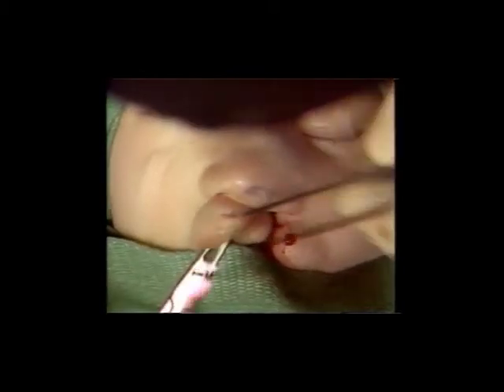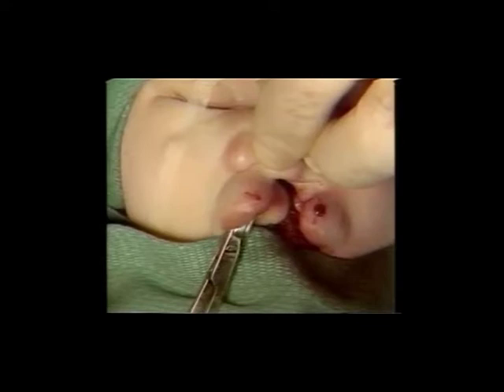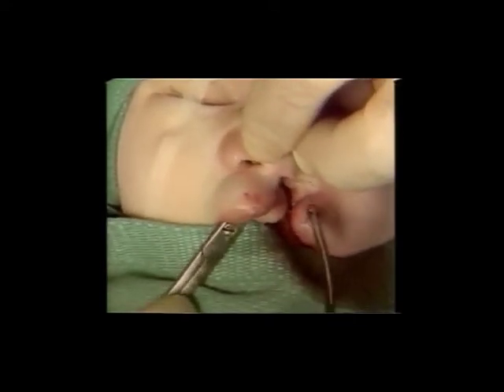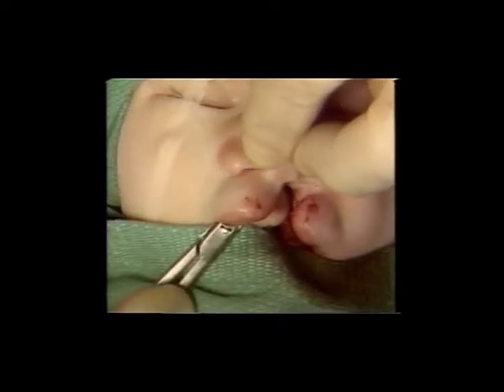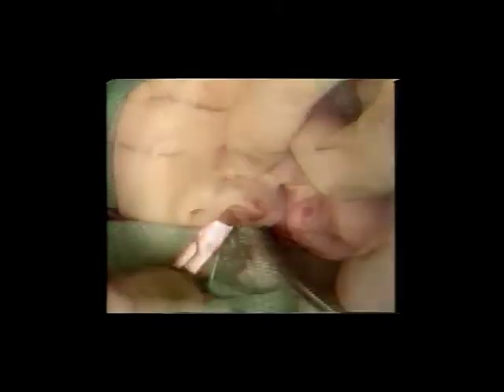A small incision is made at the labial frenum and this incision is used to admit the scissors. The medial crura are separated from one another and the dissection carried out over the septal angle and particularly over the nostril apex area.